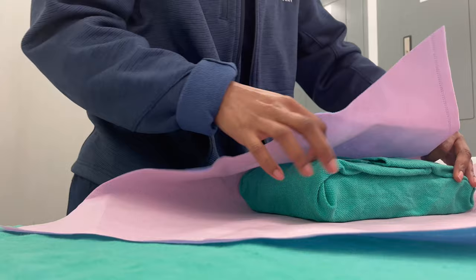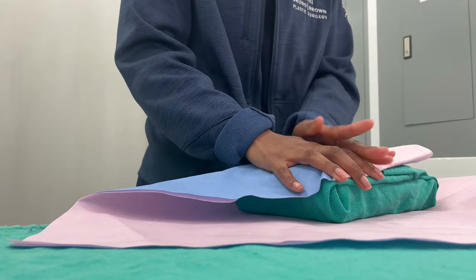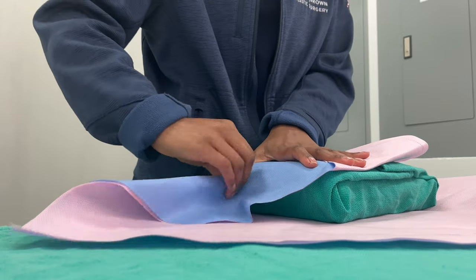So here I am doing it all over again because I just felt like it wasn't tight enough on the corners. So yeah, that's how I wrap my instrument trays.